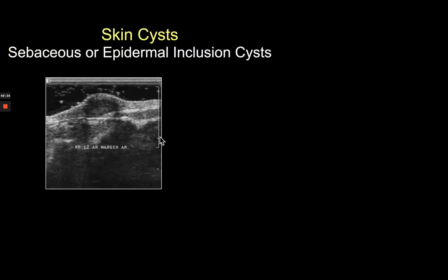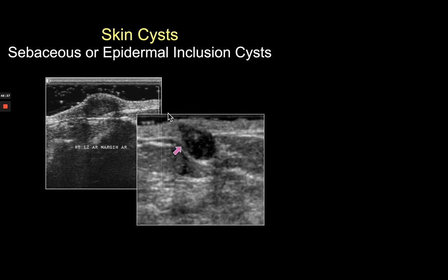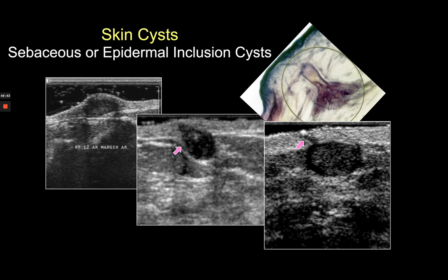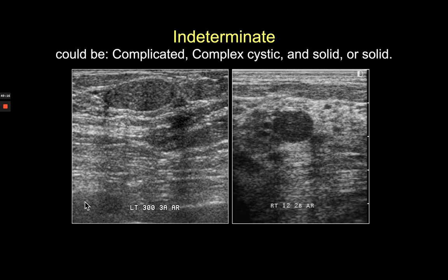Cysts arising from the skin are benign, whether completely within the skin, mostly subcutaneous with a claw sign of skin wrapping around them, or entirely subcutaneous but with a visible gland neck or hair follicle connecting to them. A gel standoff is virtually always necessary for these near-field focusing challenges, sometimes oriented slightly obliquely. These are typically sebaceous cysts or epidermal inclusion cysts, depending on whether there's been squamous metaplasia in the fundus of the gland.